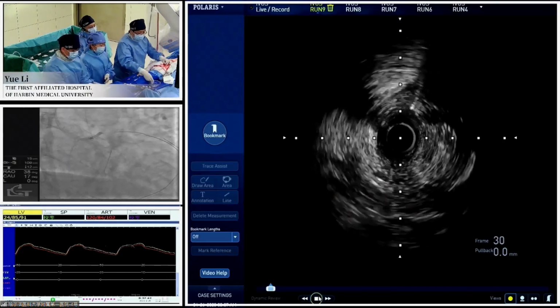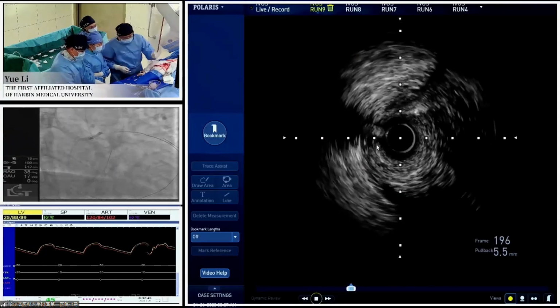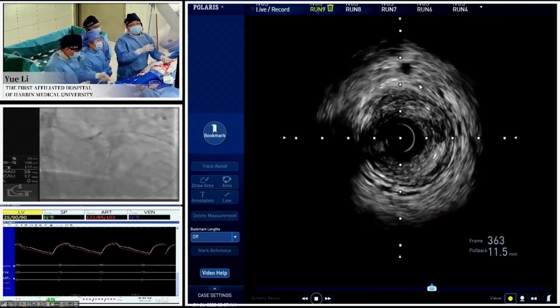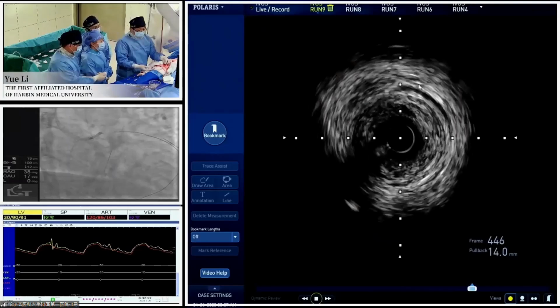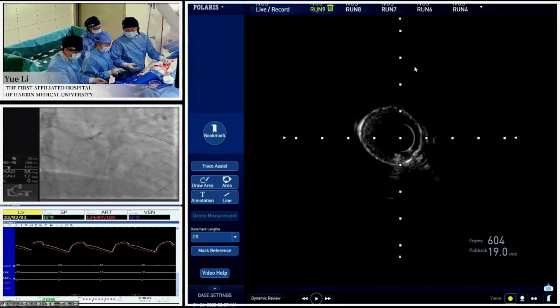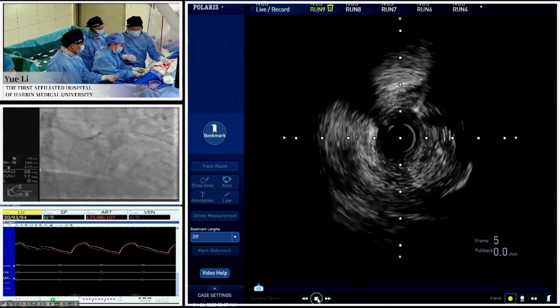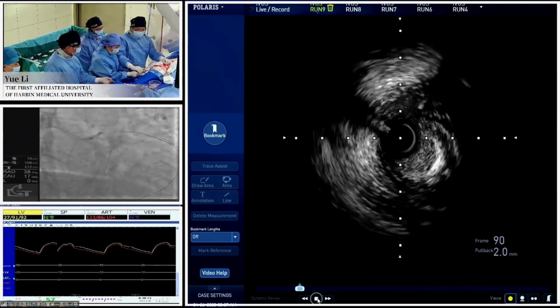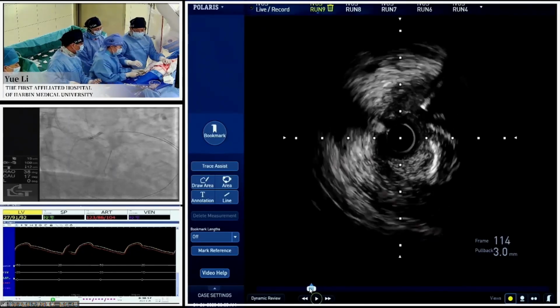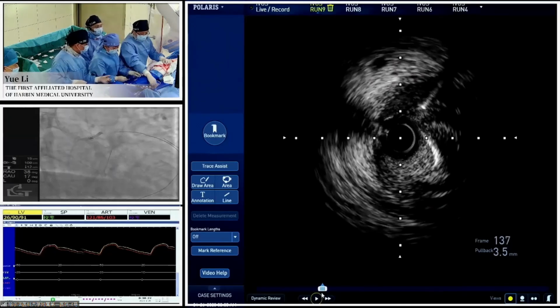The reentry point should be optimal just at the carina of the bifurcation. But in the proximal segment, going a little up, maybe in the plaque, intraplaque. The entry point is good. So in such a condition, I think guides are maybe helpful. Yes, the AGT, active guiding of the retrograde wire, and also maybe helpful in control of the potential hematoma from the antegrade.